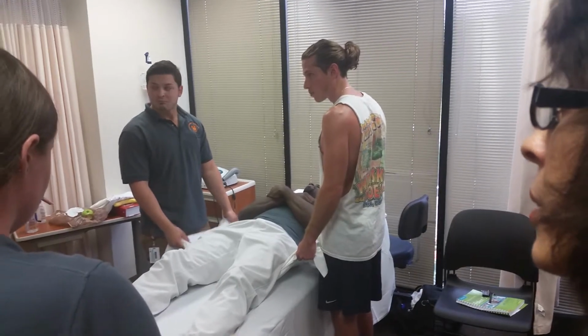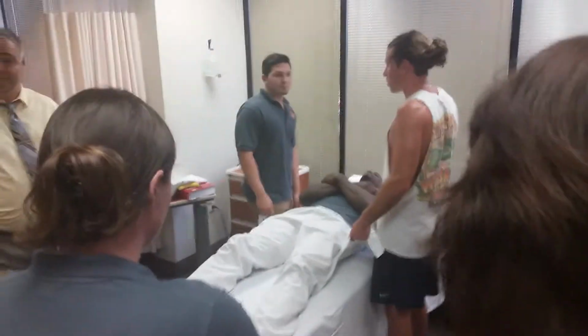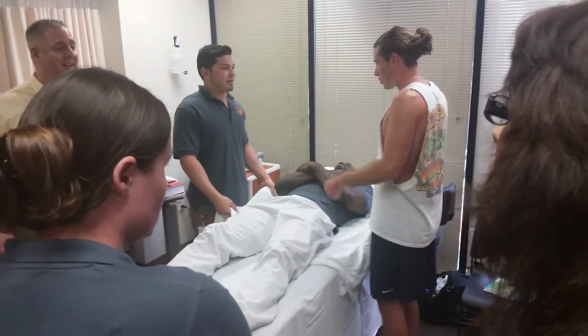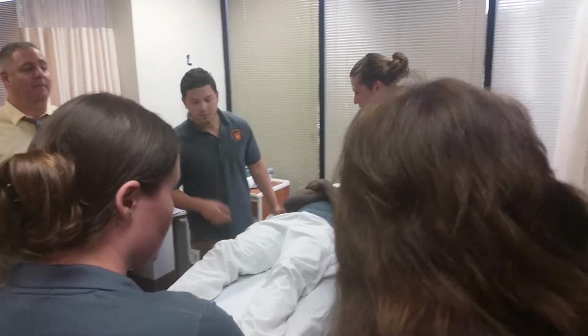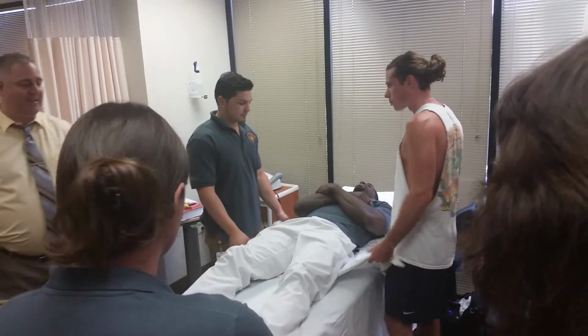Too low. So Gabe, you want to raise it up to where you think it's going to be? But then, wouldn't we want it lower so it's easier for us? That's a very good question. I squat. Yeah, right. I got nurses who are like 5'1", so I just come down to their level. Because if it's too high, it's going to be hard to lift. They're not going to, yeah. So I squat.